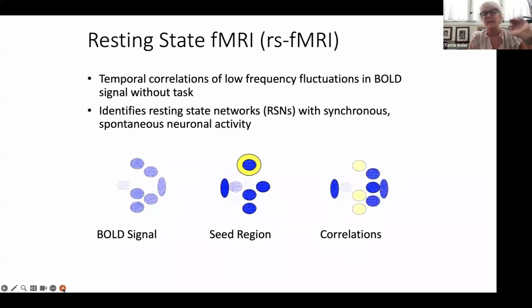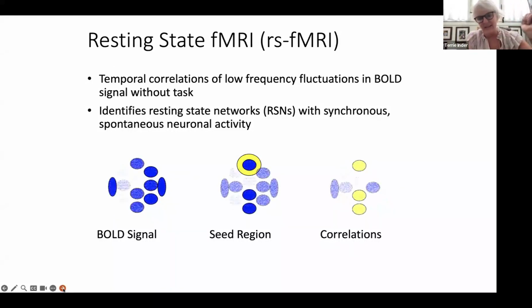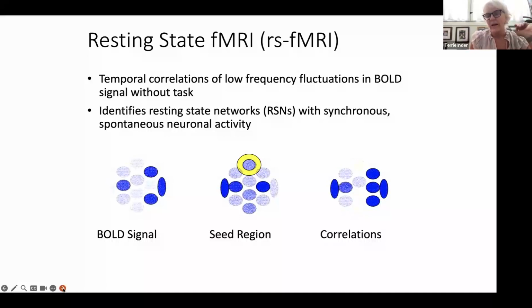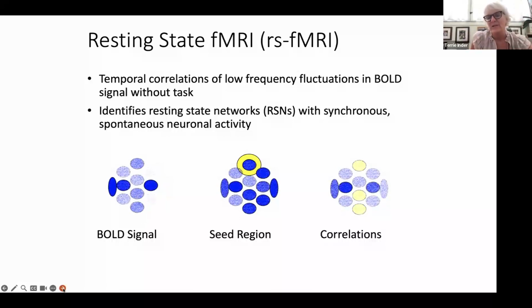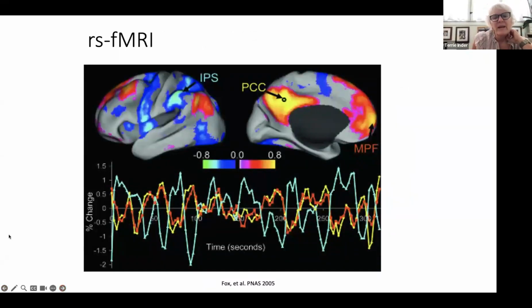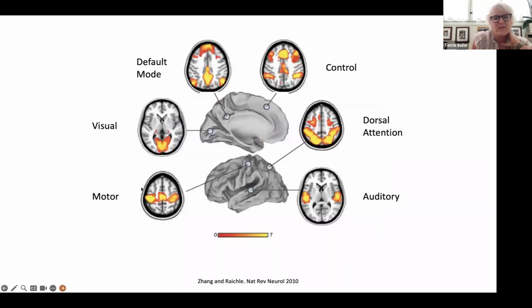We're not making the baby do anything. We're not activating a network. We're just saying when you're lying asleep in the scanner, what areas of your brain are spontaneously firing at the same speed, measured by the change in the blood flow. And we've been able to pick this up after we realized that what we were eliminating when we were looking at our functional connectivity, our functional scans, was actually not noise, but real information.